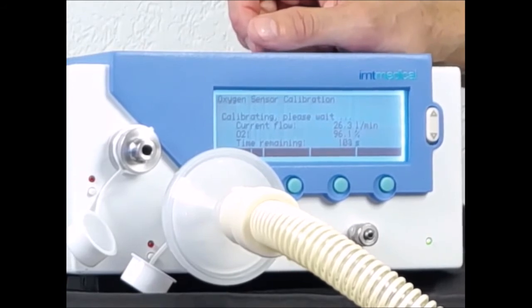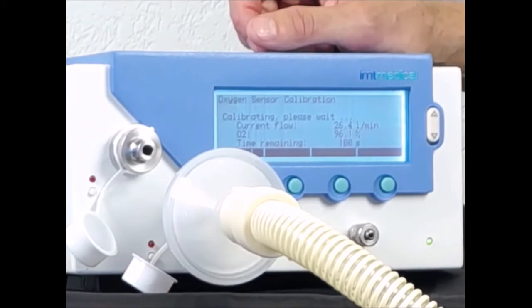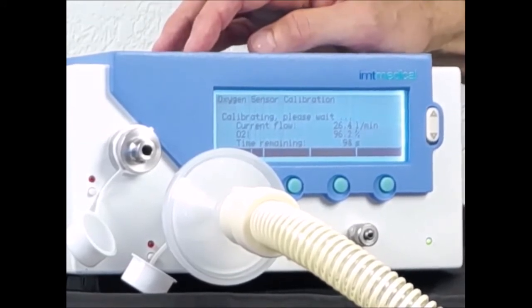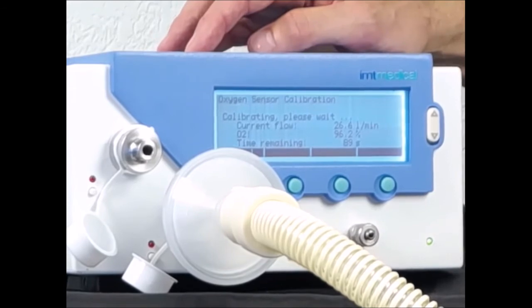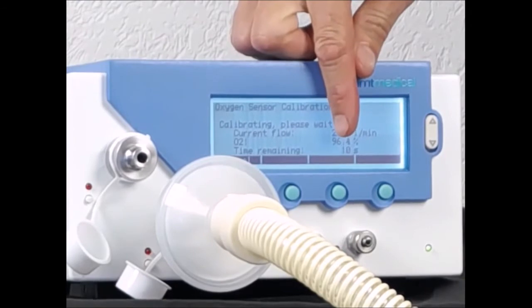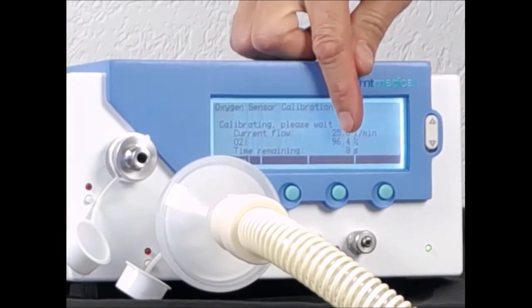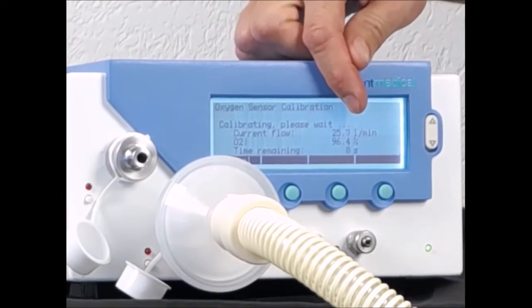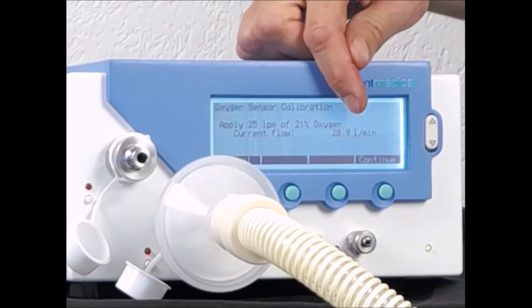The oxygen calibration in the PF300 is always a two-point calibration. Two-point calibration means one point at 100% oxygen, which we are doing right now, and another one at 21% pure air. You can do that right afterwards. The 100% point is almost done — we have 10, 9, 8, 7, 6 seconds left — and after this we will be prompted to do the same at 21% with air.